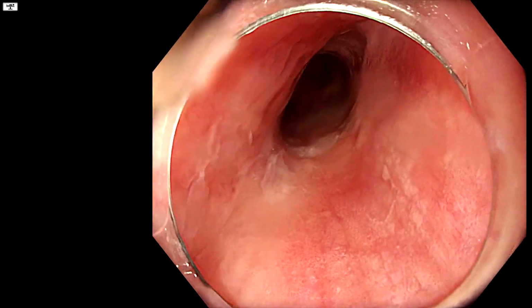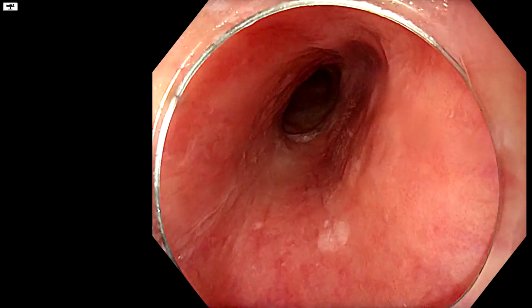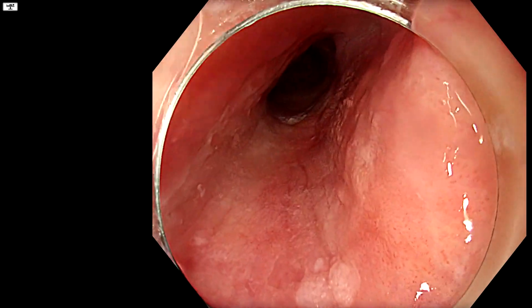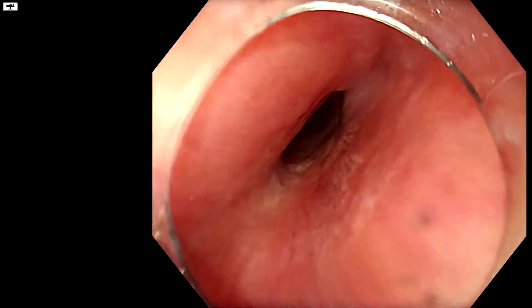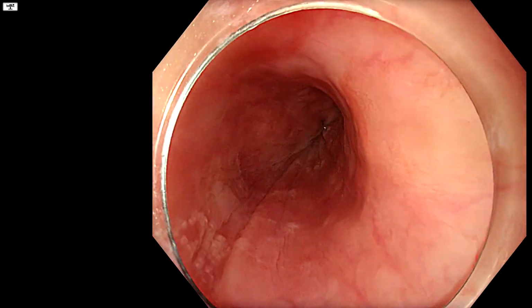So there is something wrong for me in the image at 4 o'clock, and as we come back, probably it's kind of centered on 4 o'clock, but it may extend from 8, 7 to 2 o'clock. Right, and then we just have to survey the rest of the esophagus.